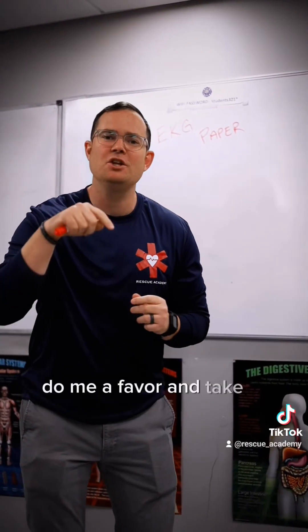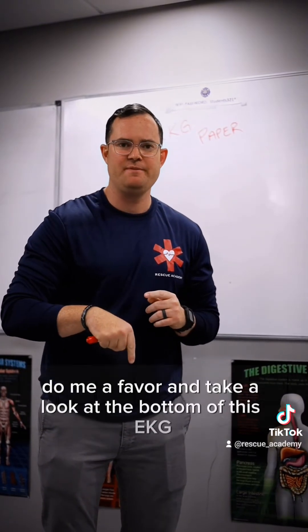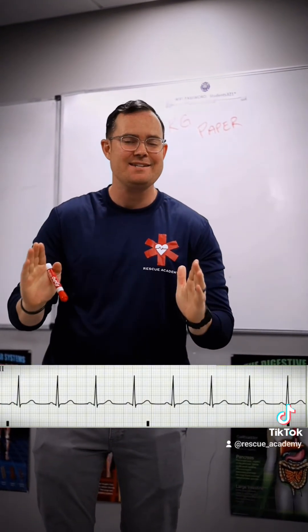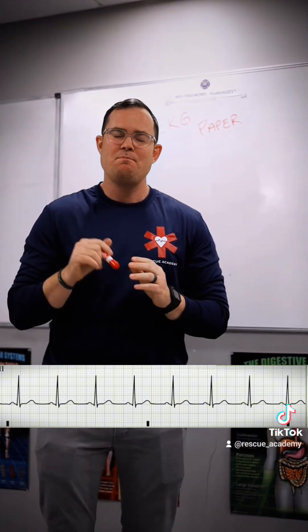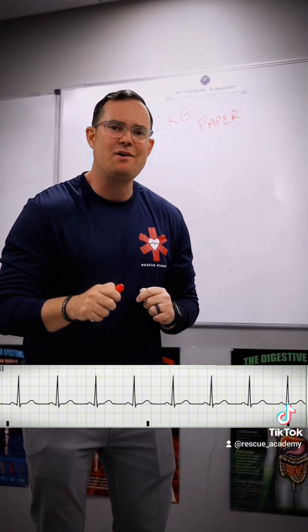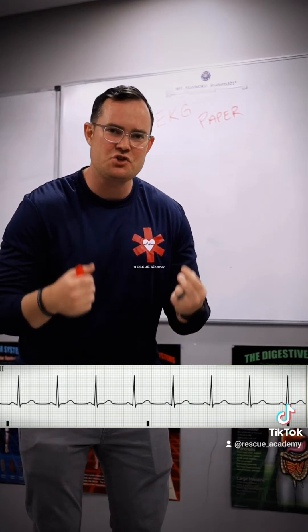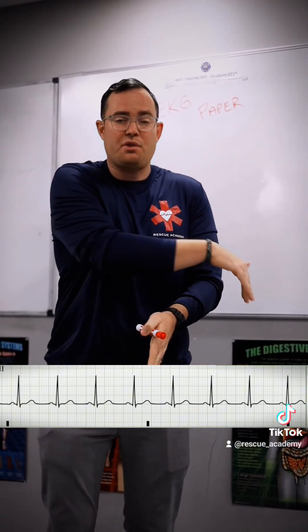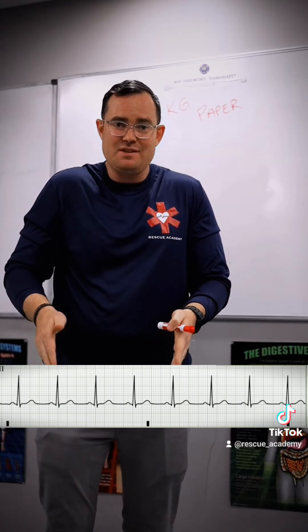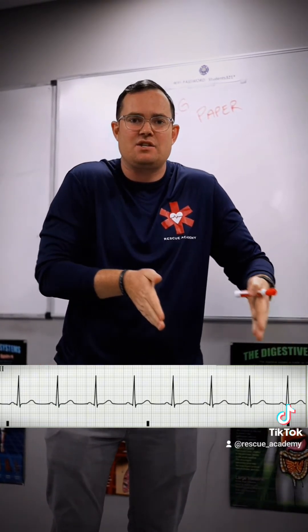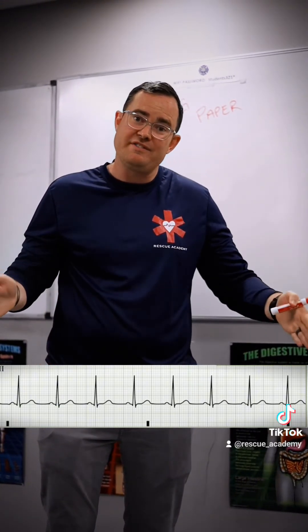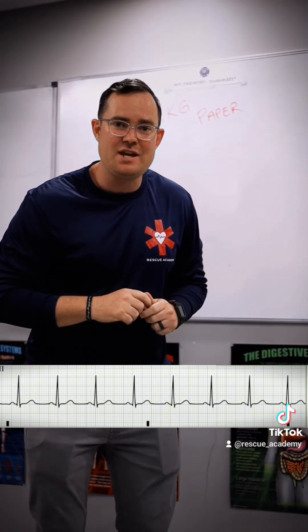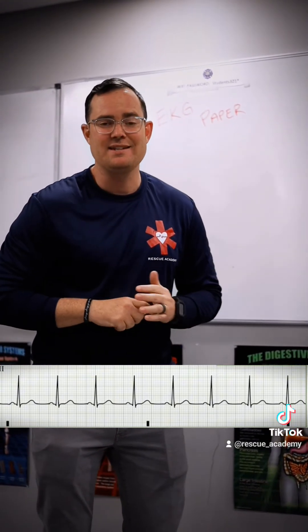Now take a look at the bottom of this EKG. Do you see the lines that signify three seconds? What we're trying to find is a six-second strip. We need to see three lines to signify two three-second sides, for a total of six seconds on a strip. Can you tell that it's a six-second strip?